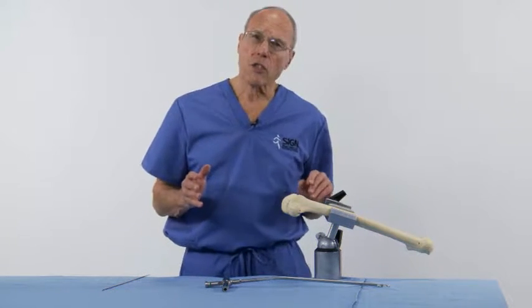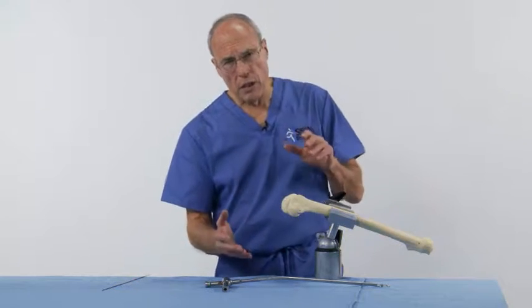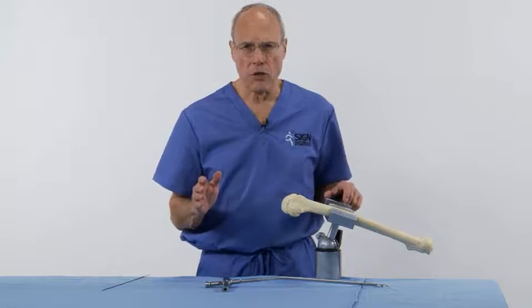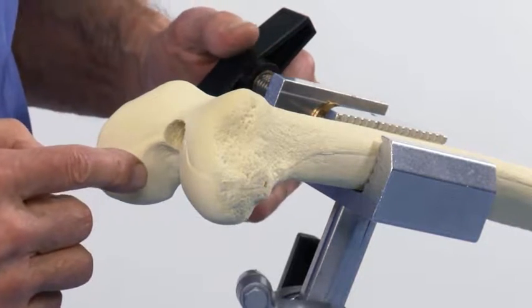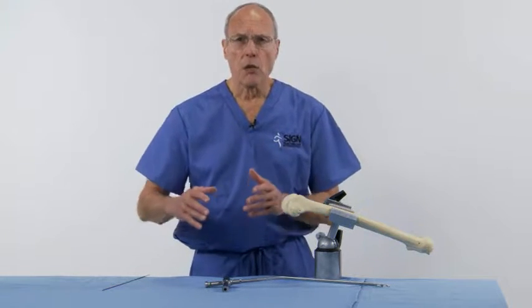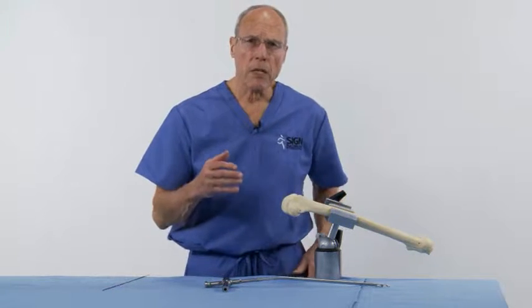Once you've decided to use the retrograde approach, test flexion and extension of the knee. You need 60 degrees of flexion to insert the nail and the reamers. If you don't have 60 degrees of flexion, you can attempt manipulation of the knee under anesthetic.